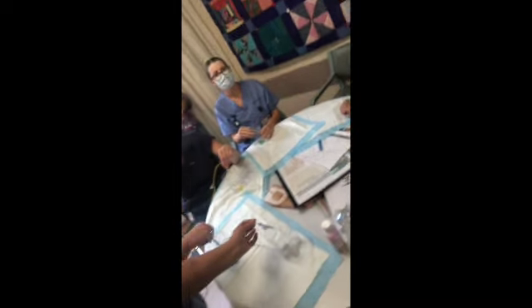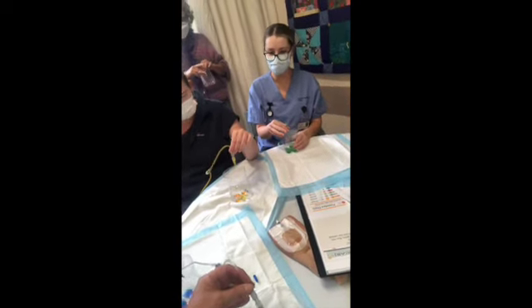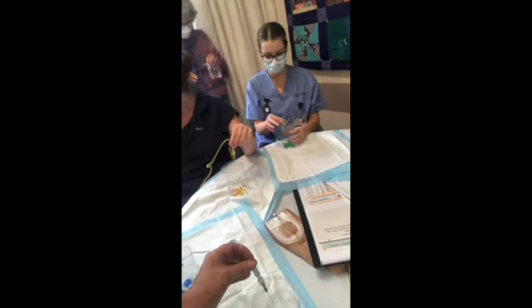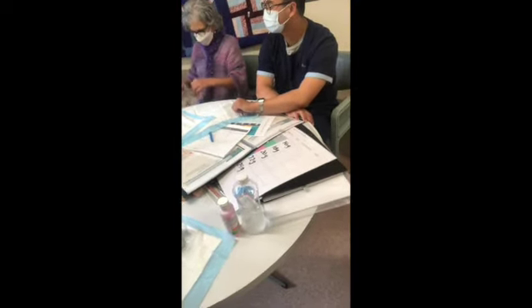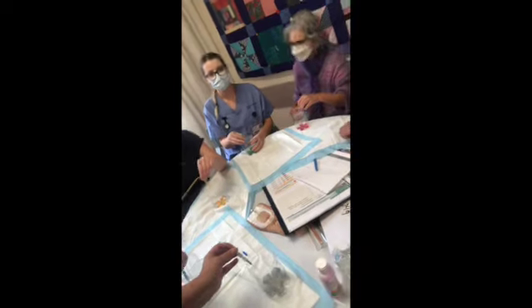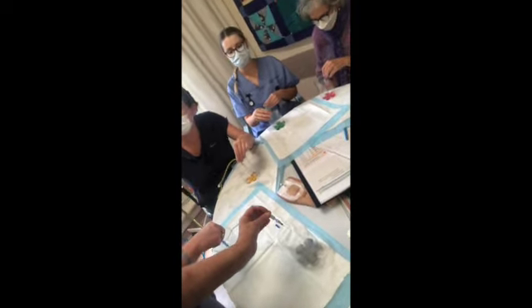So yeah, bigger size, you know, it's going to flow through easier. Looking at grey there. Look at poor little yellow over there. Oh no, terrible. How are you going with pink, Janine? Well, I'm going to have to use some gravity. So I think the point mainly is Leanne's winning because she's got the biggest cannula.